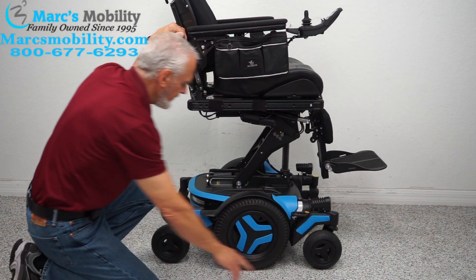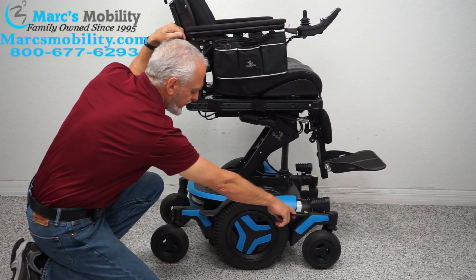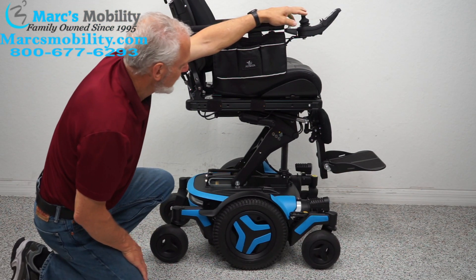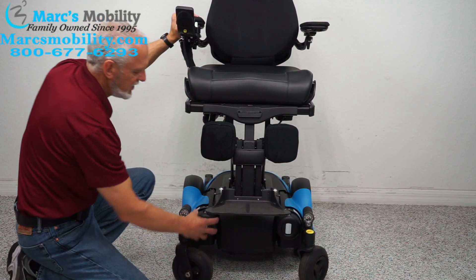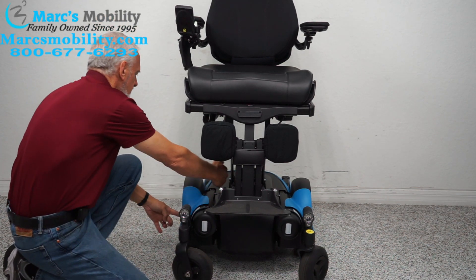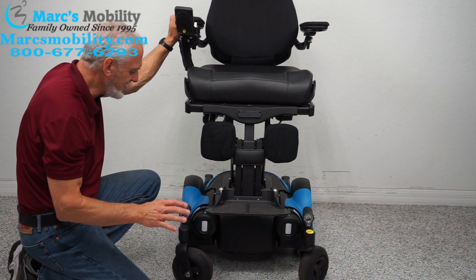You have anchor points — four of them all around the chair — to secure it for transportation. The motors on this chair are these cylinders at the front. These round motors go directly from here to the wheel — no chain, no belt, everything is direct drive. No maintenance required.